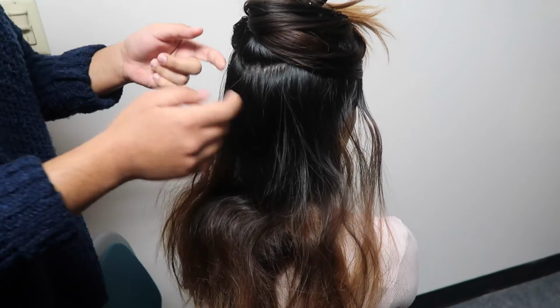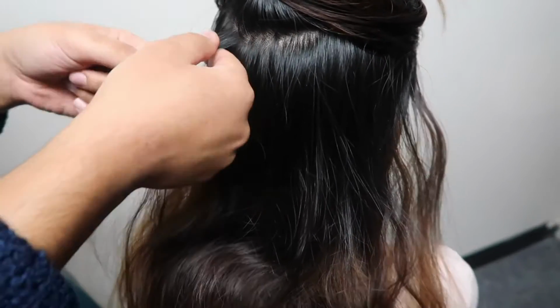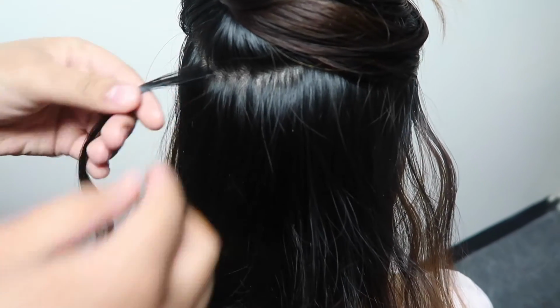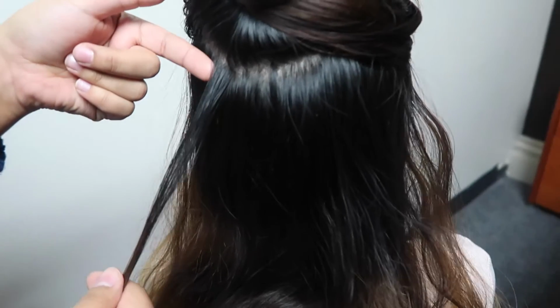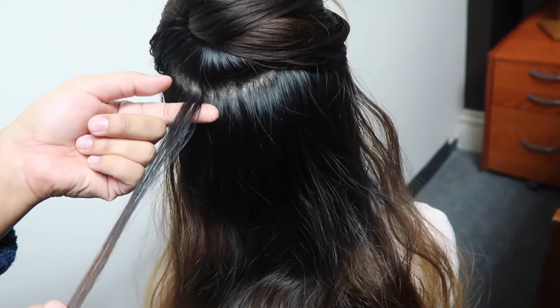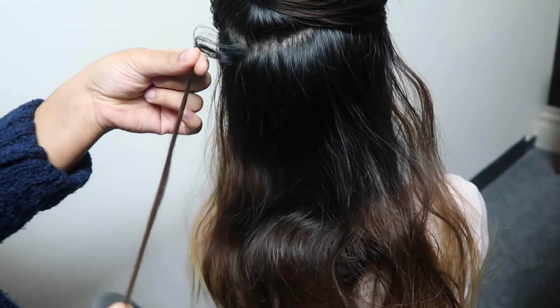Next thing you want to do is grab about 3 to 5 millimeters amount of hair. So that's about half the width of the diameter of a pencil. And you can also think about it the size of a toothpick as well. So you want to grab about this much hair. And you also want to get a horizontal slice, so that way you're grabbing it going left to right or right to left, up to you, just as long as it's more of a horizontal slice and not vertical. So you want to get about that size of a sample. Again, it's about the size of a toothpick or half of a pencil.